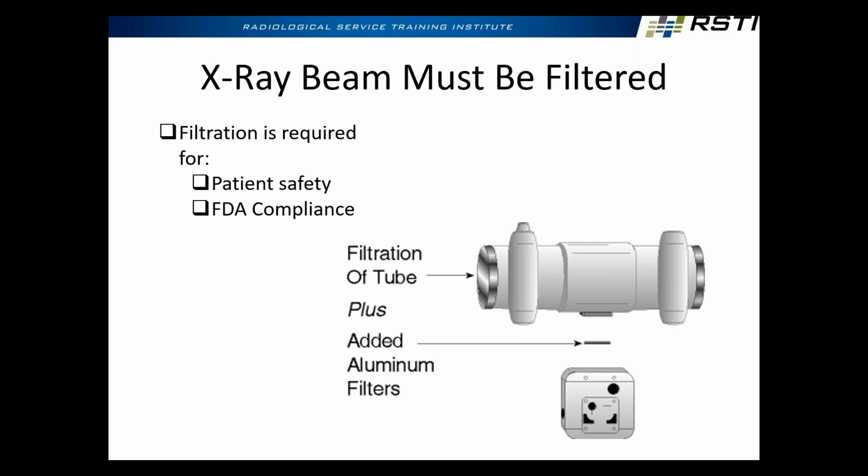Or long wavelength and short wavelength, right? Because you're going to get across the beam, you're going to get up to whatever your peak kV is, but you're also going to get everything below that. So if you think of it like a string of lights, in order to make the top light light up, we have to light up all the ones below it, right? Wherever we stop, that's going to be the peak, but we still have to have everything below it as well.